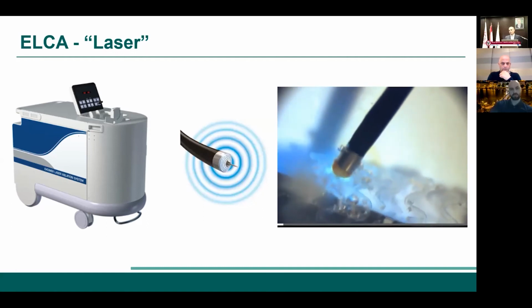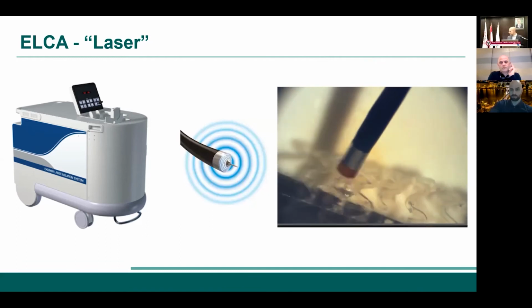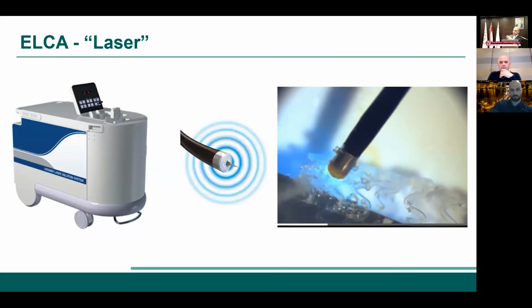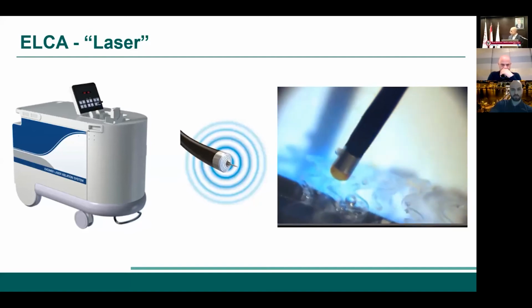And we used to image and say, can we debulk a bit the neointima? You probably know in the United States, drug-eluting balloon did not exist, still does not exist, and probably will not exist for a certain number of years. So the rationale was, you laser a bit, modify the neointima, and then put the BVS and expand it as much as you can, trying to embed these bulky struts.